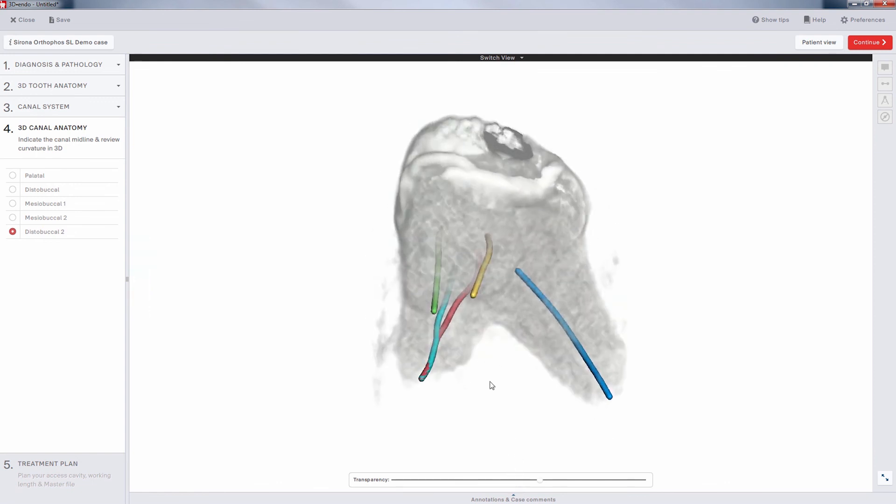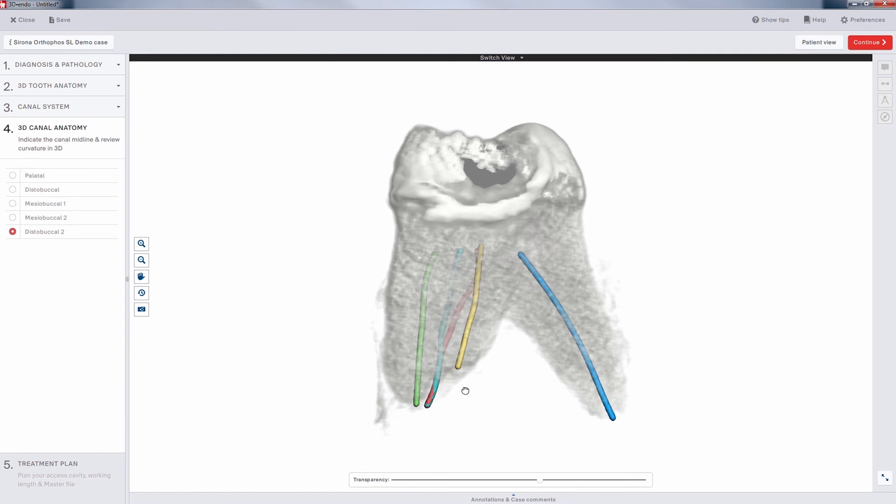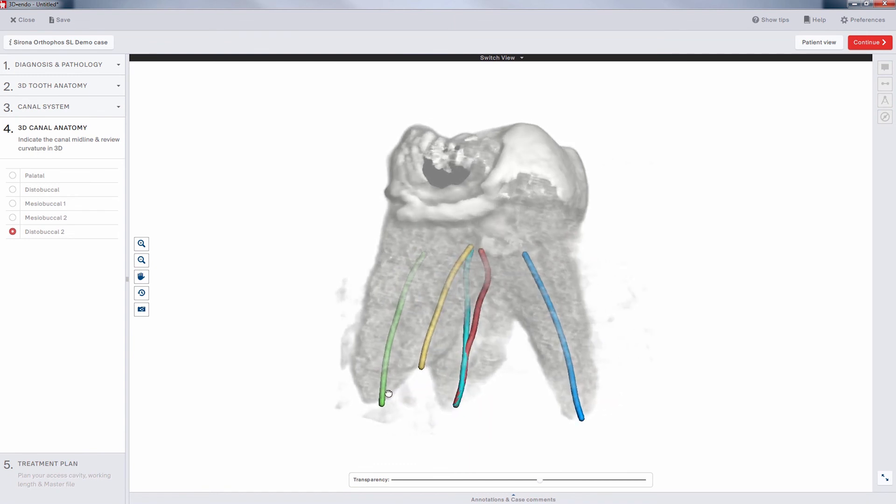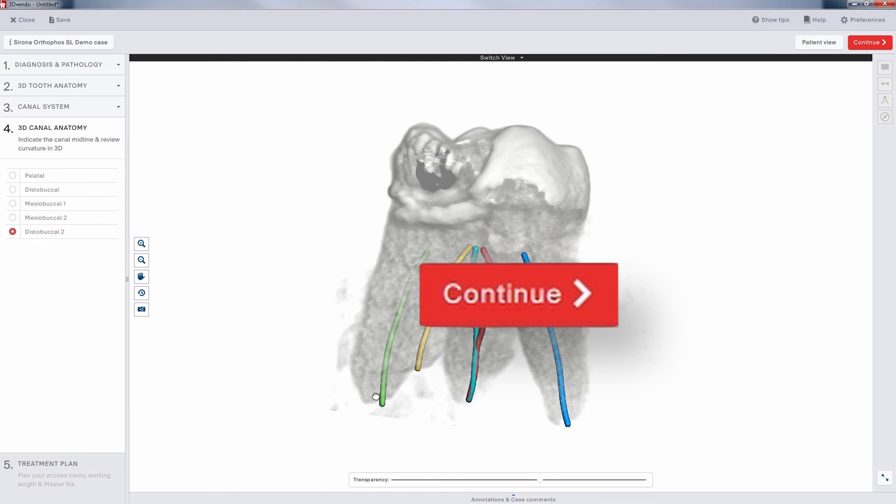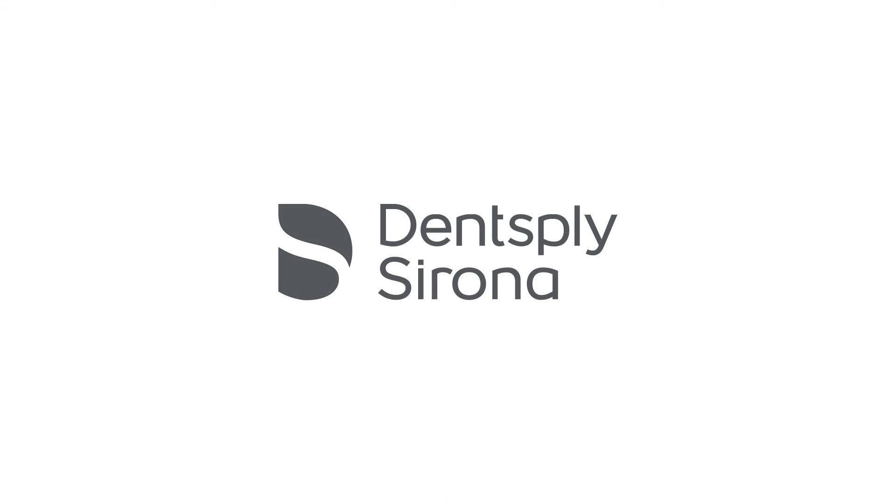With this view, you can anticipate curvatures and see where canals merge, all before ever opening the tooth. When you're satisfied with your canal trajectories, click the red Continue button in the upper right-hand corner to go to Treatment Planning.